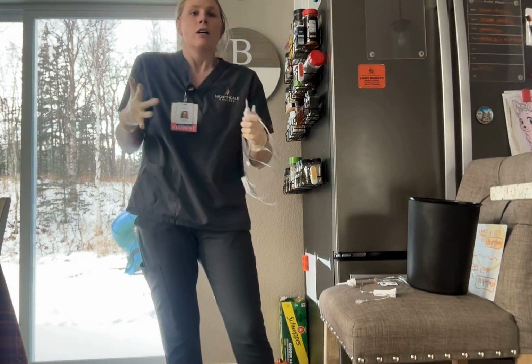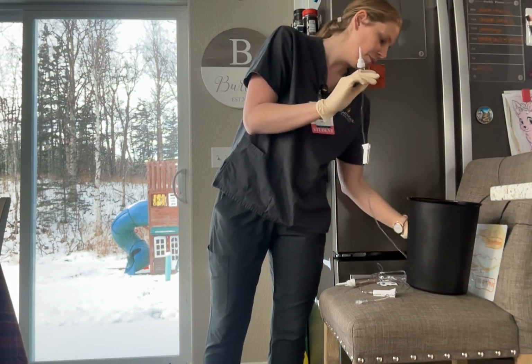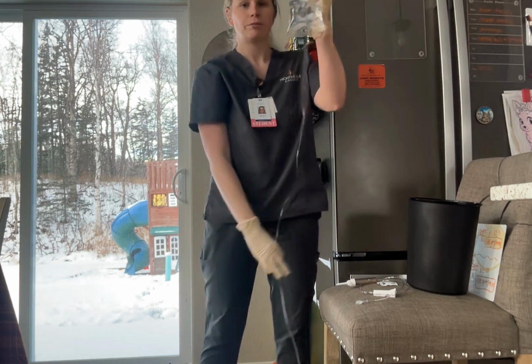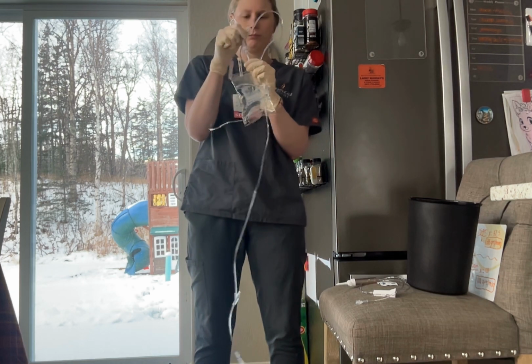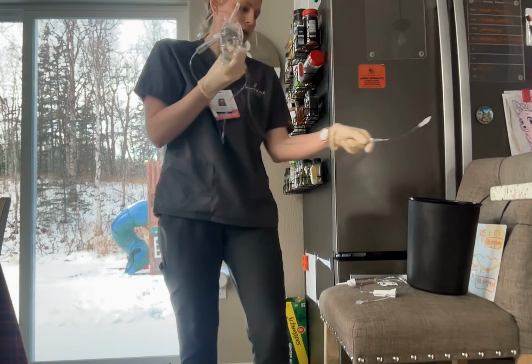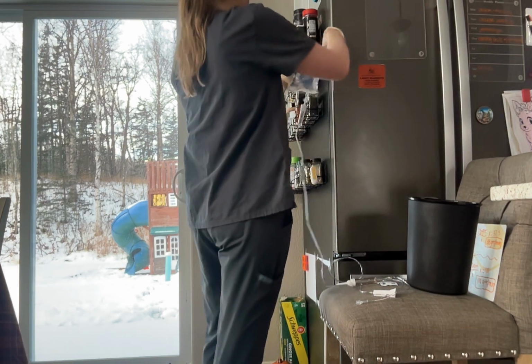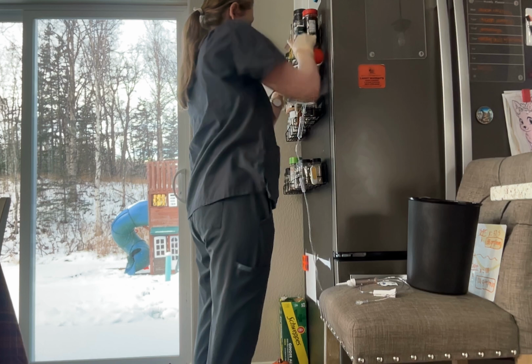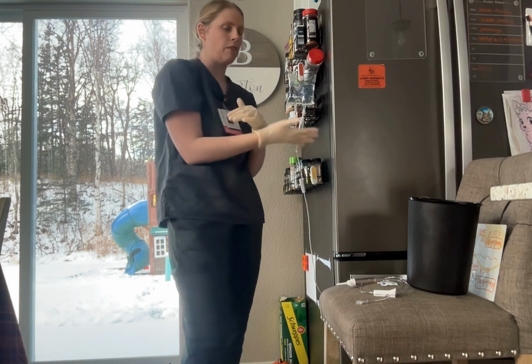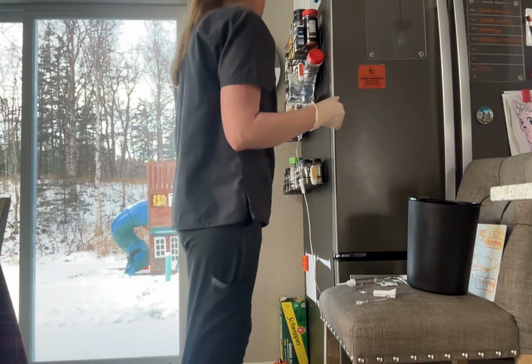Okay, so now we're going to go ahead and spike the bag of normal saline. This did not touch the floor. Okay, the bag is spiked. We're going to make sure the catheter is in sync, and we are going to put the bag upside down 30 inches above the patient's IV site, which is her peripheral. So this is 30 inches above the patient's IV site. We're going to go ahead and prime the tubing.